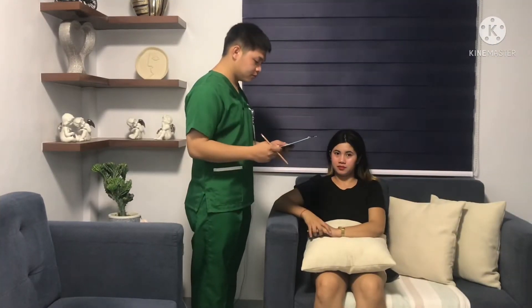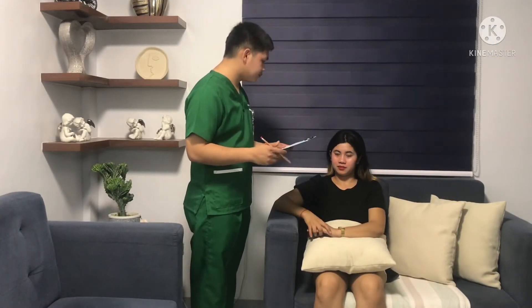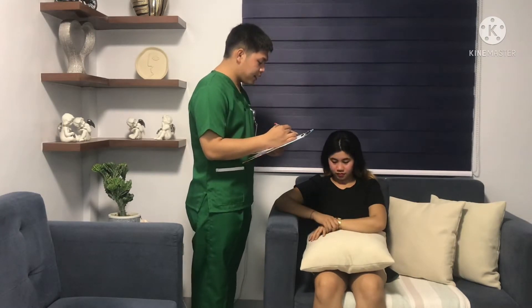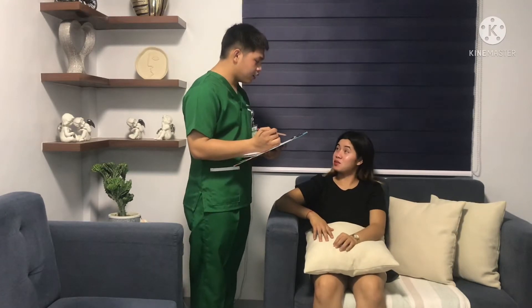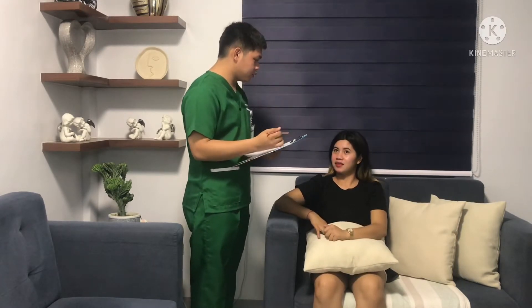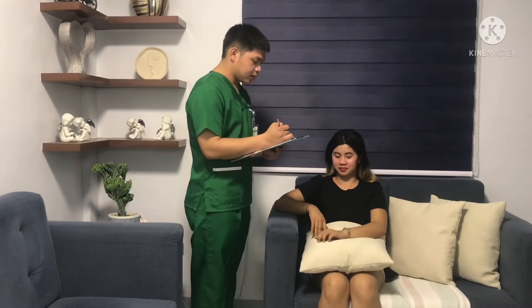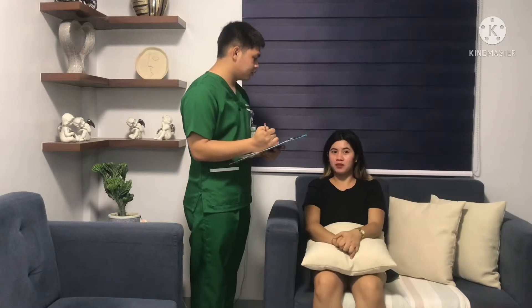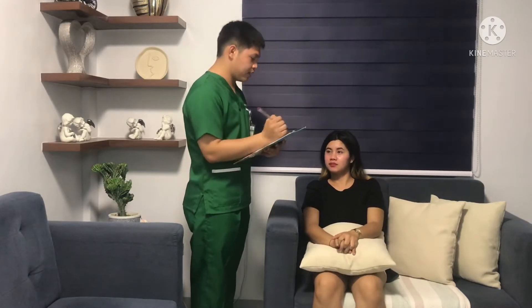Review the patient's medical history and current medications. Assess the patient for signs and symptoms of hyperglycemia or hypoglycemia, to correlate data and pursue acute action due to an onset of symptoms. Determine if the test requires special timing, for example, before or after meals.